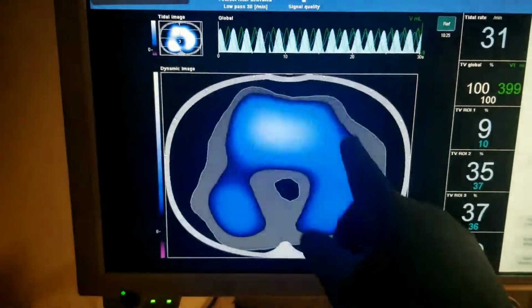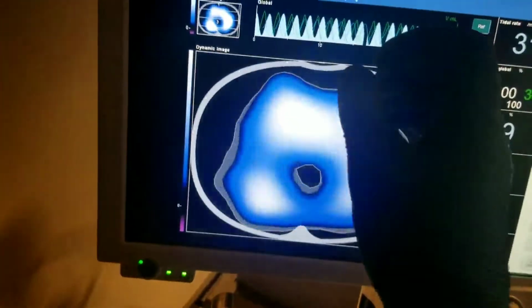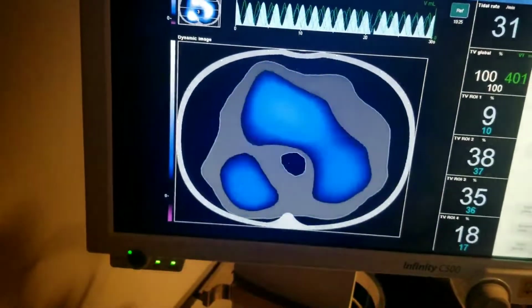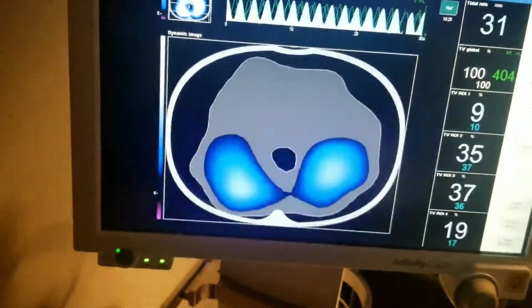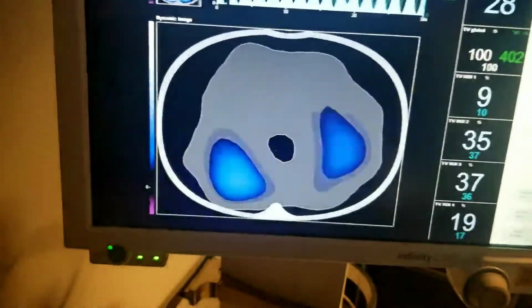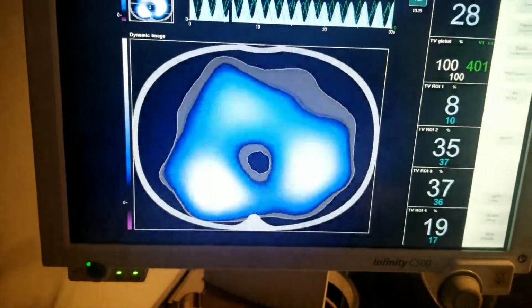So when you have 395, you can multiply that by the percentages and find out the volume distributed specifically to those regions. The white intensity is where the maximum of ventilation is. Overall, we don't have just this clump of white showing that that area is taking the majority of the power from the vent. So overall, this is a normal, good distribution of ventilation. Patient, like I said, is currently on a PEEP of 10. So we're just going to titrate and do a PEEP study and fine-tune that PEEP level.